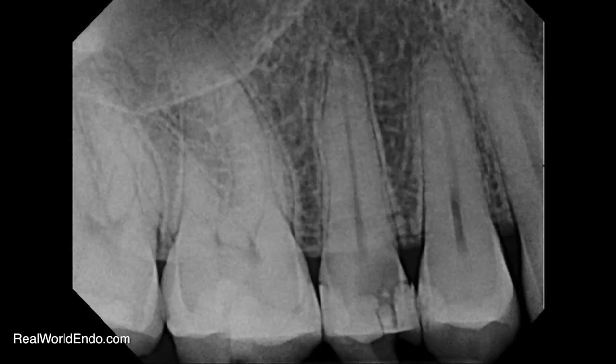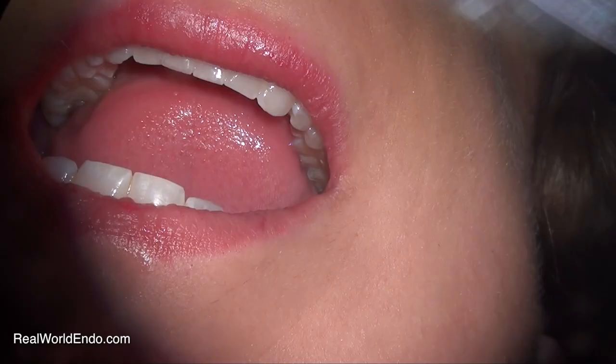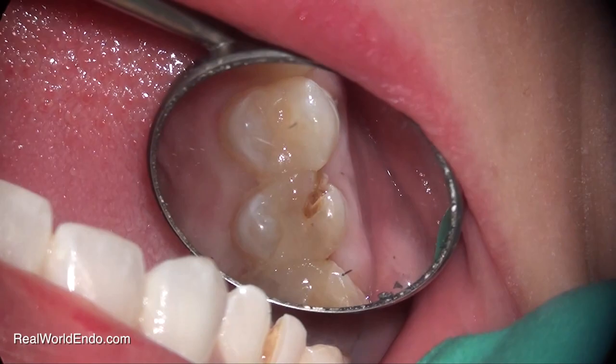The tooth in question is a maxillary second premolar. As you can see, lots of decay is present underneath this old composite filling, and there's a possibility of crown lengthening. Here we can see the tooth clinically in the mouth, and at higher magnification you can see that there is a large amount of decay underneath the mesial aspect of this tooth, underneath the old composite filling. Oftentimes, this is due to a lack of flossing as well as a poor restoration.